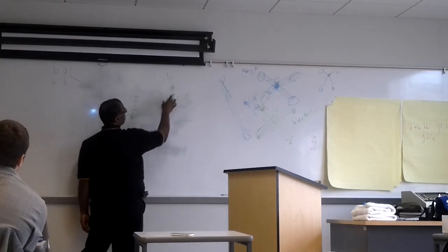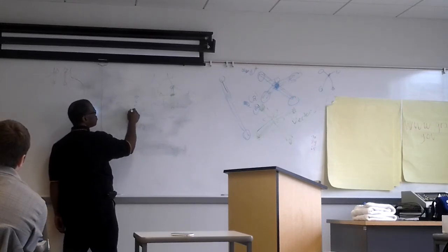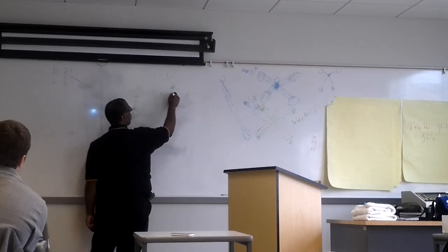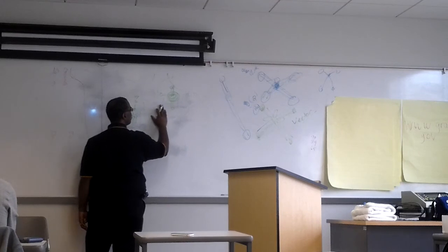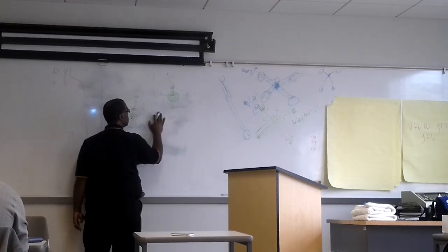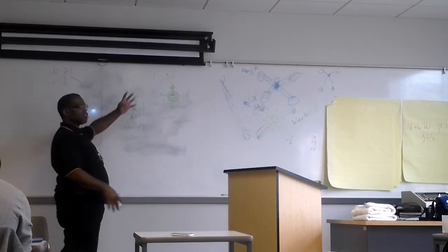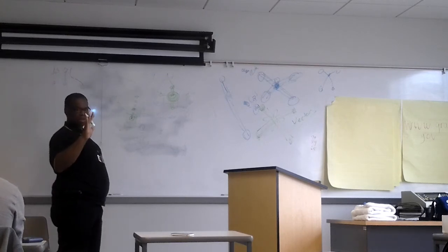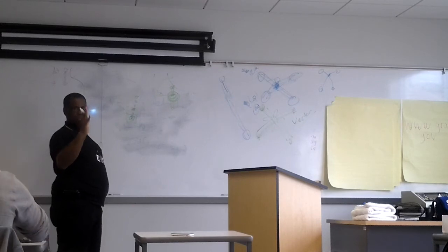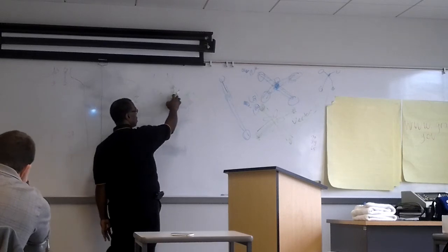And you say, well, do you feel it now? Kinda. Well, you can go, let's say, for example, to number 4. If I choose number 4, I can have this vector move out just a little bit and rotate in this whole area. So the stem will move around in this area, and the person will feel the stem move around. You can choose a large sweep, a fast sweep, or a slow sweep. So you can sweep like this here, or you can sweep like this here. And they'll feel the movement of the stem go around.